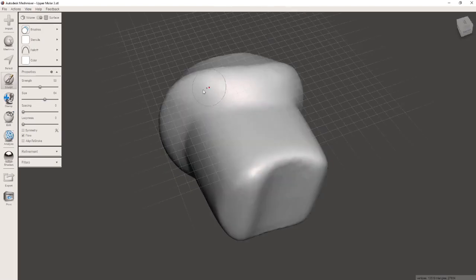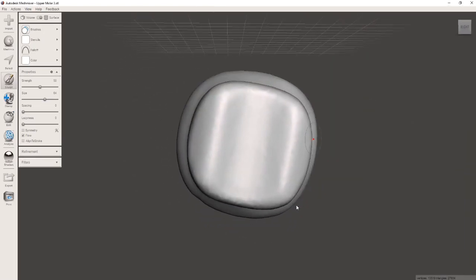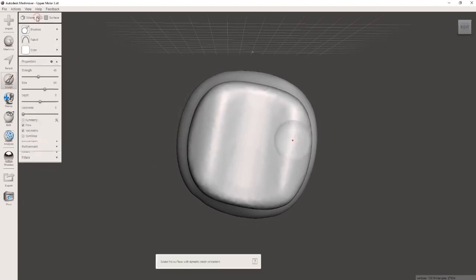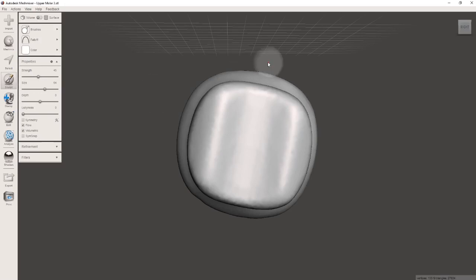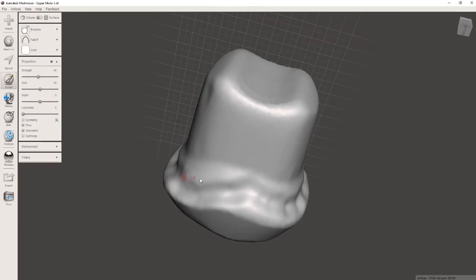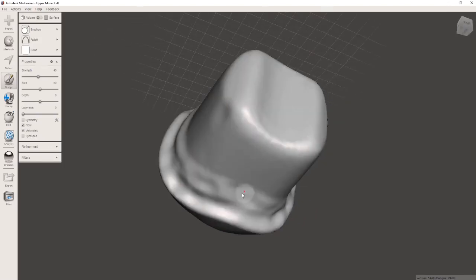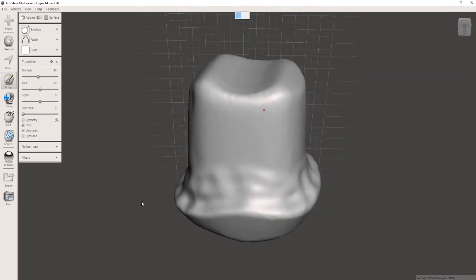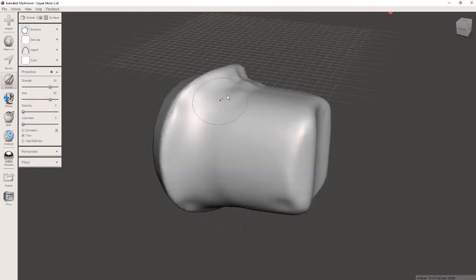And then I position the die in the occlusal view and go to volume in the sculpting tool and select the plus sign, hold the control key on the keyboard, take away and reduce the margin. I can also adjust the margin a little bit to reshape it to my liking. Also, imperfections can be adjusted. And then I go back to the smoothing tool and smooth everything out.